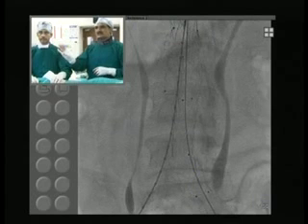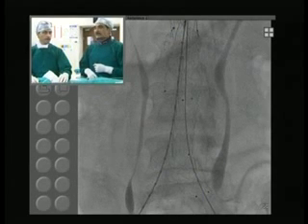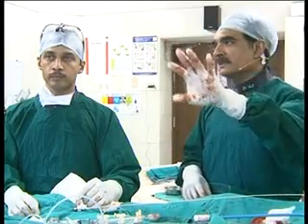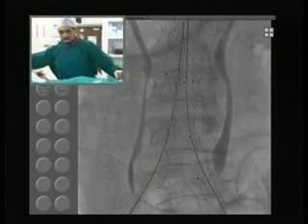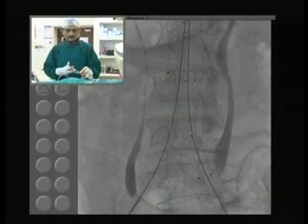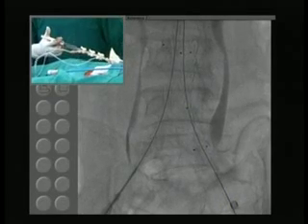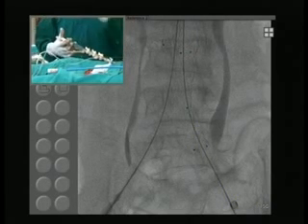AP view, or maybe you stay there. Now the other thing is we need to be able to see that iliac bifurcation. So what we'll do is we'll freeze the image on the screen and then we won't move the table. Okay, so you take off the pigtail. George, the plan is to do an angiogram right now. Okay, here we go. We'll show lower down, please. We are going to take a picture of the iliac bifurcation, freeze it in that position, and then we'll know that that's where the device has to end.